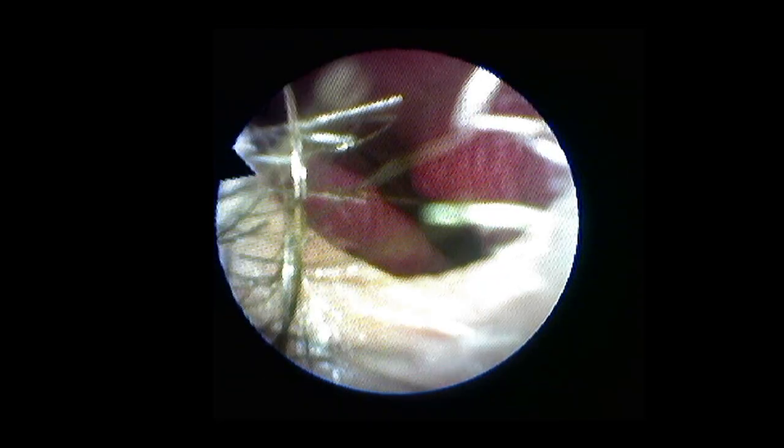Now I'm going to pass the scope through your nose down into your throat to look at your larynx. I want you to breathe out of your mouth, and if I pinch you, please say ouch and I'll make it go a different direction. In performing flexible laryngoscopy, either nostril can be used — in this instance, we are using the right side. Going through your nose now; this is often the little pinchy part.